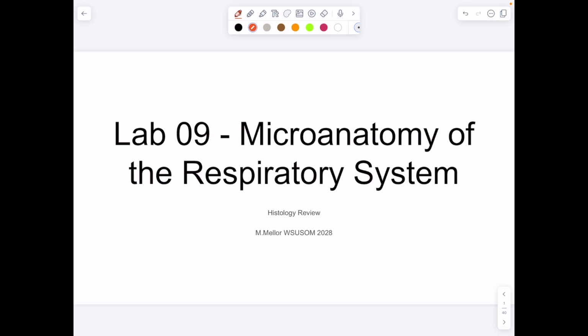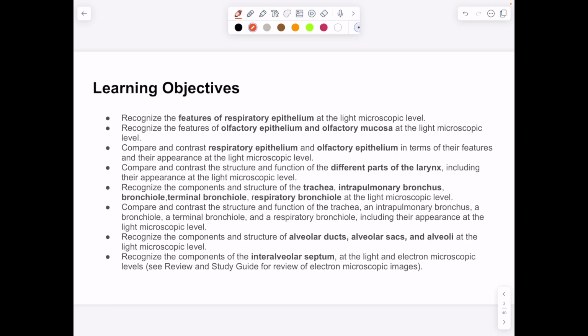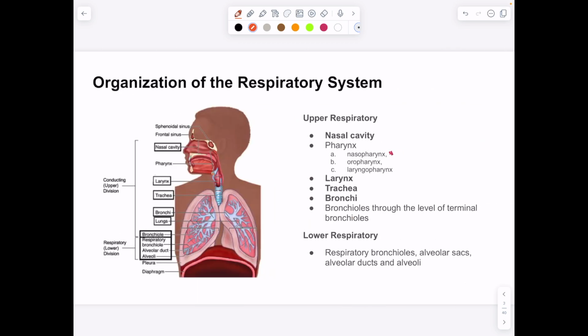Hi guys, this is a review video on Lab 9 for Histology, the microanatomy of the respiratory system. It's pretty long, but we're going to try our best. Basically, we are looking at the upper and lower respiratory systems, specifically the nasal cavity.